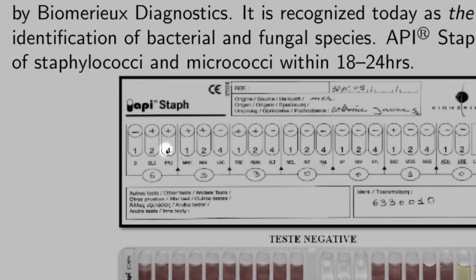So what are these weights? Well, these are the importance of the test. The test that is more important, this is 4 times more important than test 1, so it is given a weight of 4. Here it is less important, so it will be given a weight of 2. I mean, less important in the identification process for the staphylococci.